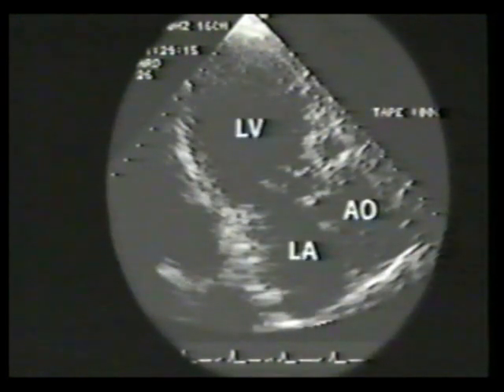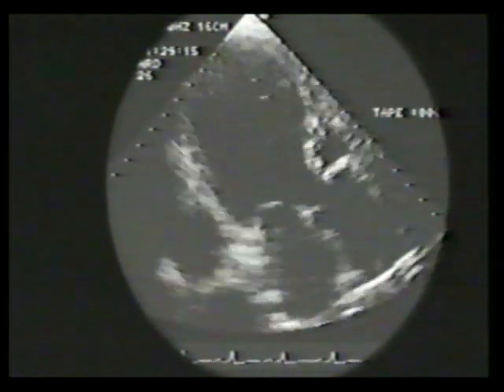This patient presented for echo because of aortic dilatation noted on chest x-ray 1 month after an episode of severe chest pain. In diastole, on this parasternal long axis view, intimal flap prolapses into the left ventricular outflow tract. This is the aortic arch from a suprasternal transducer position. An intimal flap crosses the horizontal portion of the arch.